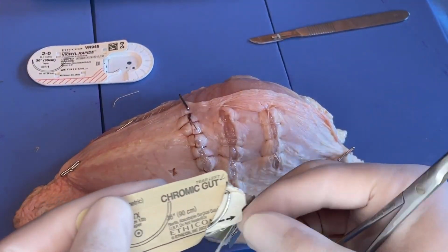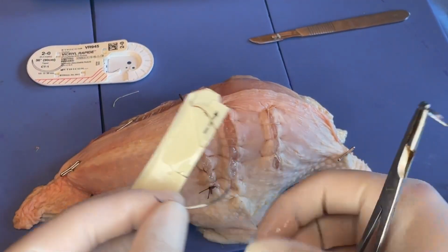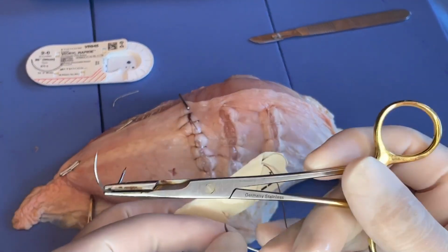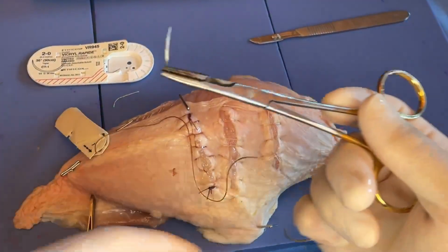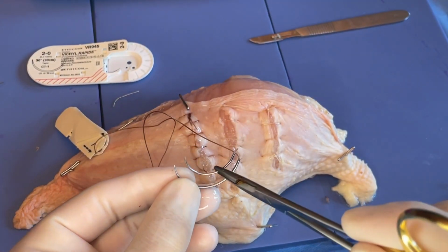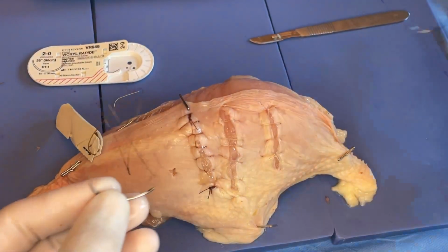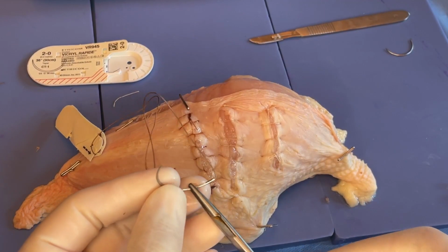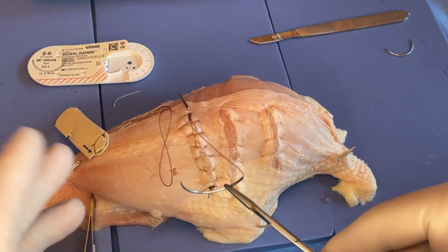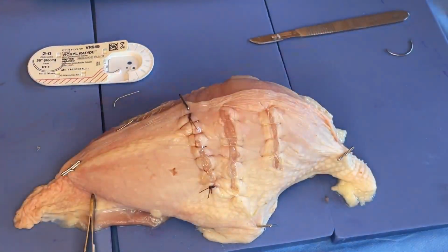But as we pull this out, we can compare the size of this needle, the CTX, to our CT1 that we just used for our running interlocking suture. So you can see the difference in size there between CT1 in the needle driver and the CTX that I'm holding. The CTX is just a little bit of a hardier needle, quite a bit longer, with a bigger radius, and hence a bigger diameter to the full circle that it makes.